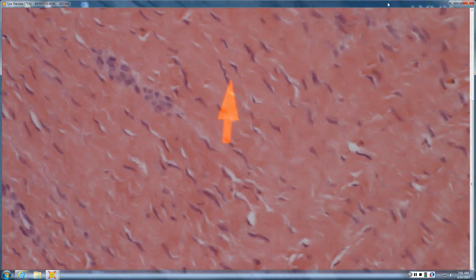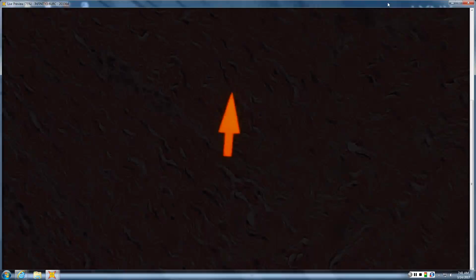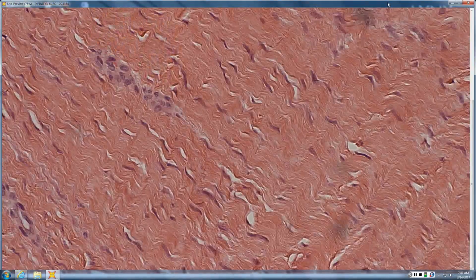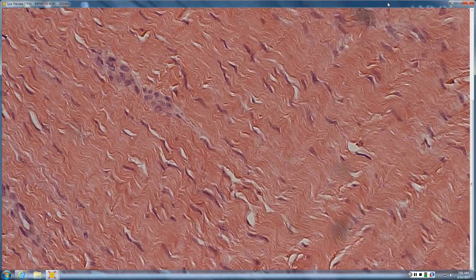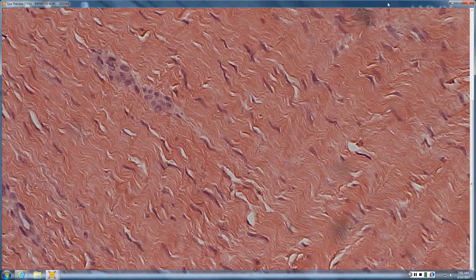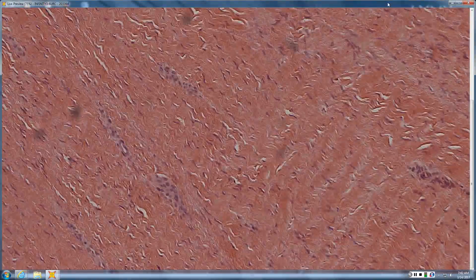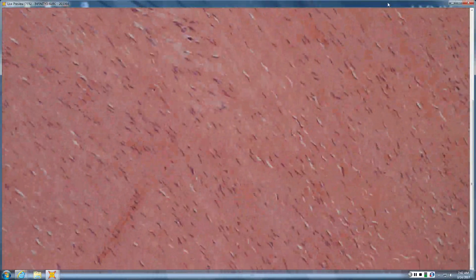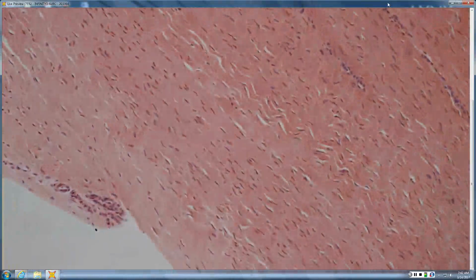And if you flip down your condenser, both the collagen and the nuclei have the same kind of corkscrew configuration, suggesting one gave rise to the other. So you have corkscrew fibroblasts that made corkscrew collagen. And so you are absolutely correct, fibromatosis.